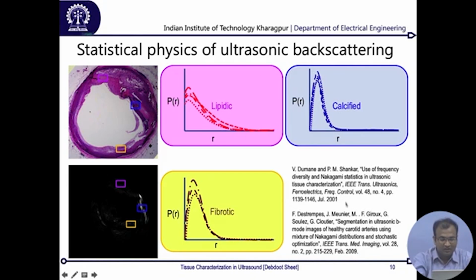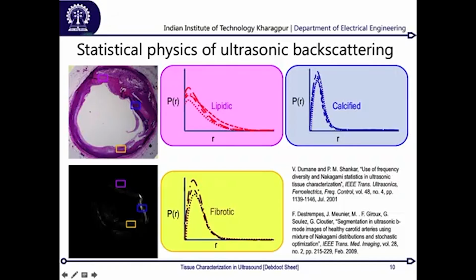There were a lot of papers in earlier days which also made use of these kinds of properties in order to discriminate, but under an assumption that you needed to manually delineate a mass of tissue, because whenever you do parameter estimation within an estimator framework, you need to decide how many samples to take. That would mandate a cohort group of samples which are similar to each other. Although they were doing it manually, our task over here is to make it a totally automated process where you get signals and you just analyze them.